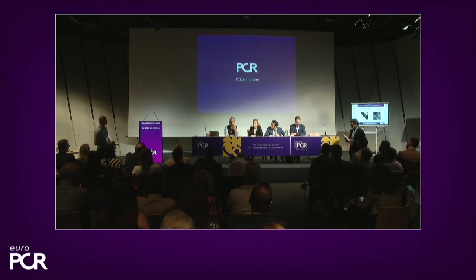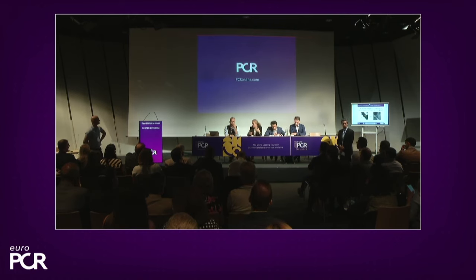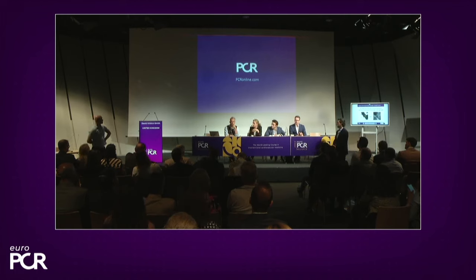Patient prosthesis mismatch has been discussed since the 70s in the surgical community, and I think in most departments it is usual treatment that we have lists in the OR with the mean EOAs that can be expected, and we always calculate the expected EOA for the individual patient before we implant a valve. So I would say that's what most surgeons do, and that's something we could also implement for transcatheter heart valves: to build lists with mean effective orifice areas for each size and type of valve, so that we can predict which effective orifice area we could expect.